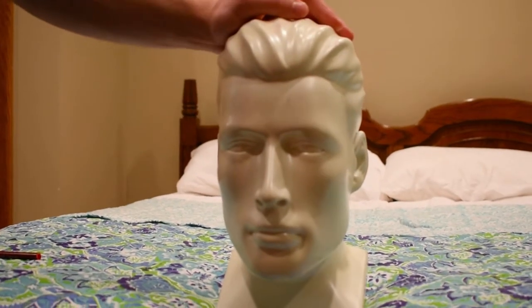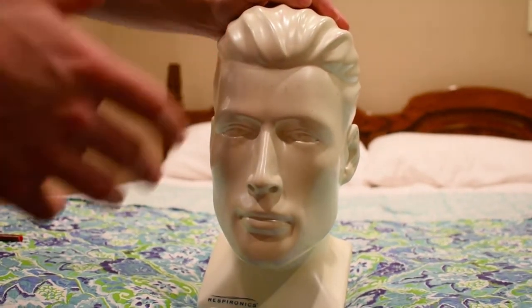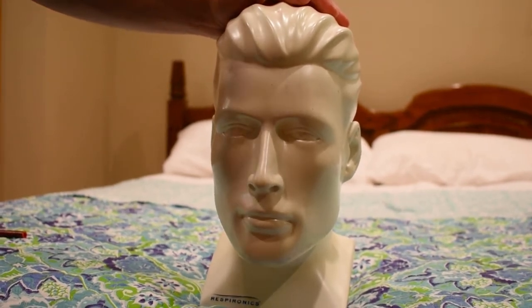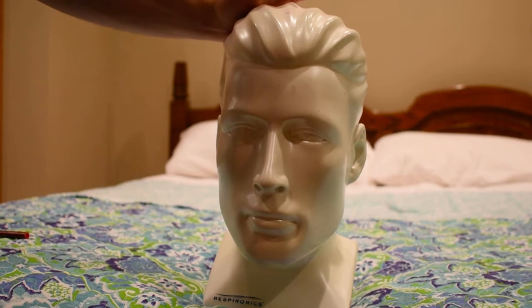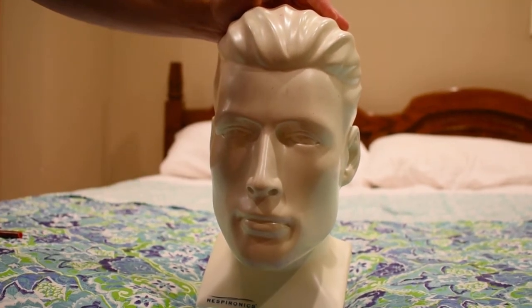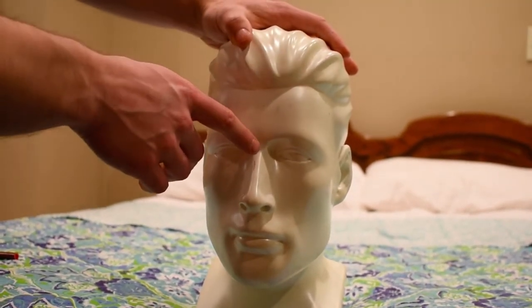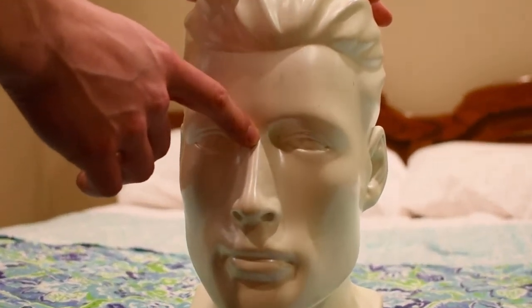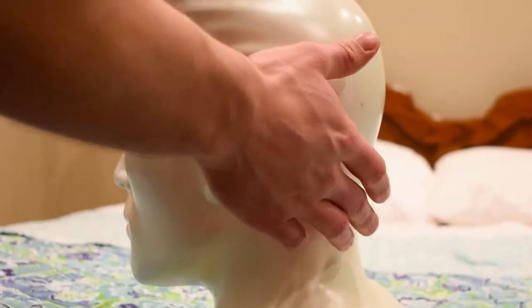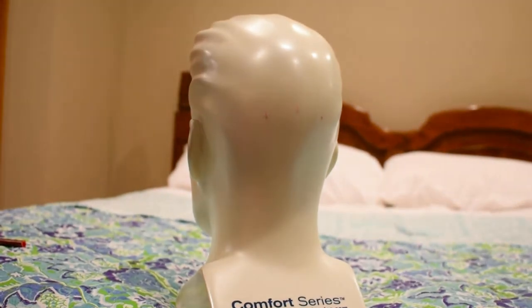Alright guys, so I'm going to go ahead and show you how to perform the standard 10-20 system for polysomnography hookup. So, like I said before, those 4 anatomical landmarks are imperative to locate before starting your measurements. So first thing, we have our Nasion, which is essentially the bridge of the nose. And then we have the Inion, which is at the back of the head. It's also known as the occipital protuberance. You could feel it on the back of your own head.